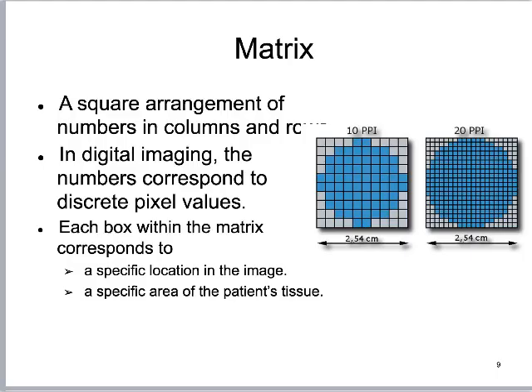Now the other thing that controls the size of matrices, right, again, is something that we can relate to. It's more of a physical way of thinking. But in all honesty, the thing that tends to trip students up the most is this, which is kind of weird because I think we get the pixel size thing, if that makes sense. We kind of can get the drawer thing with the pixel bit depth, but then we stumble understanding matrices. So the best way I can think about matrices is really kind of crass and weird, right?